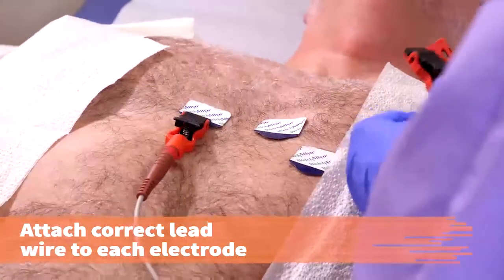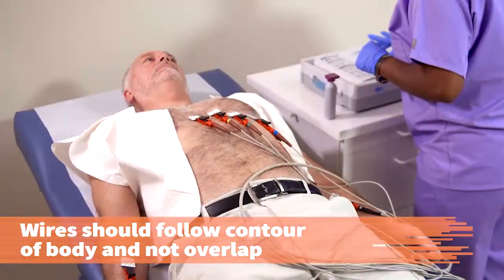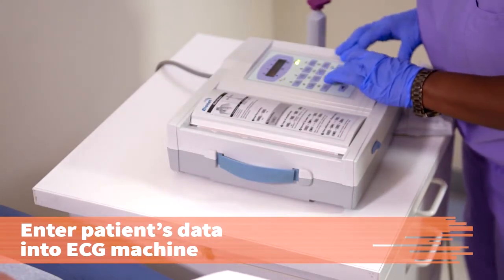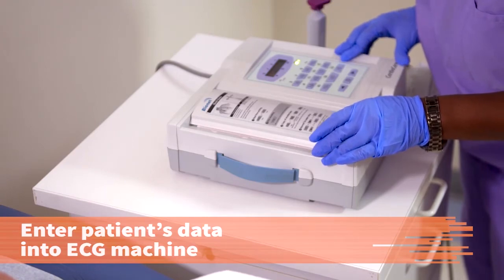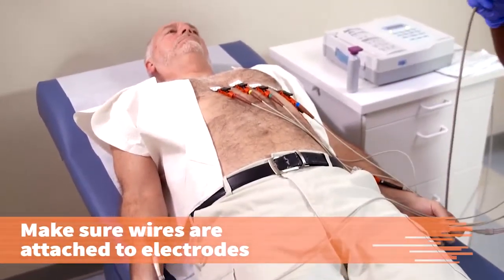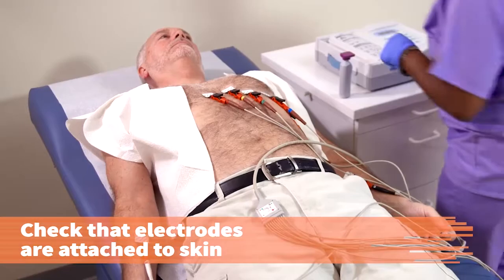Attach the correct lead wire to each of the electrodes. To avoid artifacts in the ECG, wires should follow the natural contour of the body and not overlap. Enter the patient's data into the ECG machine. Identify any changes with the default settings, electrode position, or patient's position. Before you begin the tracing, make sure the lead wires are in the correct position and are attached to the electrodes. Check that each electrode is attached to the patient's skin and take any corrective action necessary.